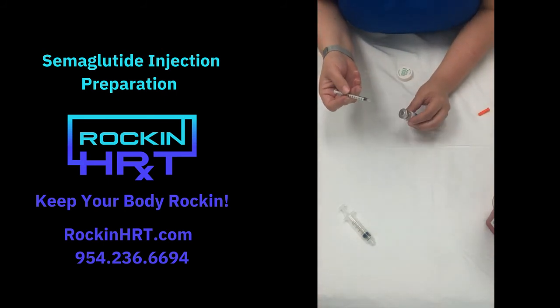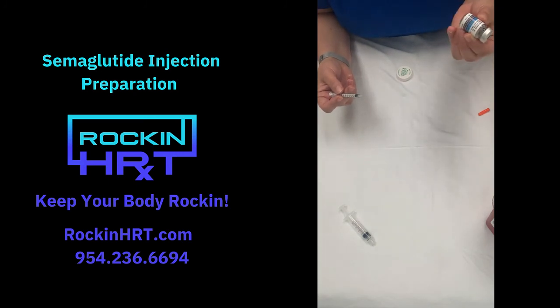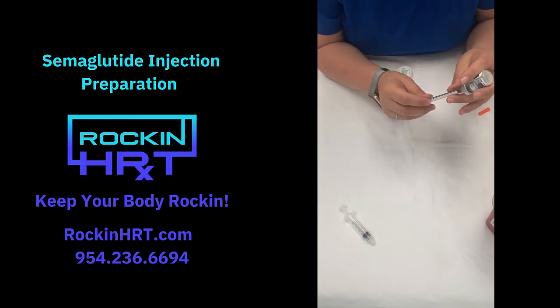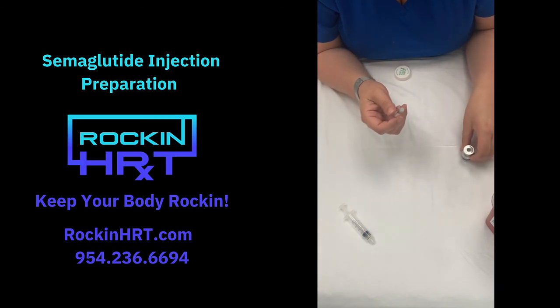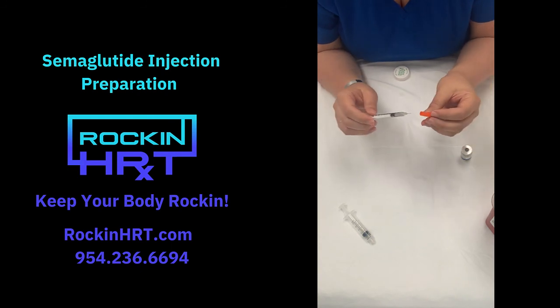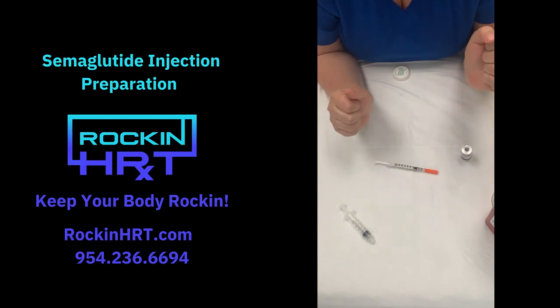So what you're going to do now — it's all diluted — put the needle in the top, hold it upside down, and pull back on the plunger until you get to 0.25. You might need to hold it there for a couple of seconds because it's going to fill up slowly. Make sure you're right on that 0.25, then just pull it right out. If you'd like, recap the needle, and then we can get ready for the injection.